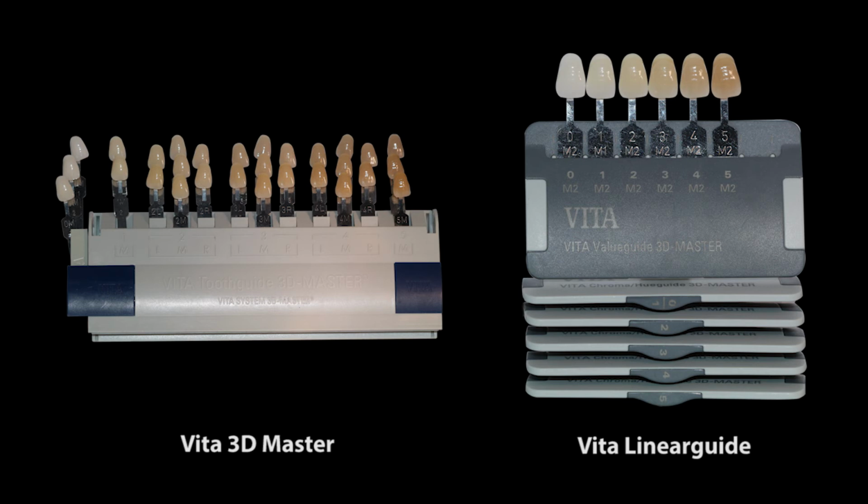It's a phenomenal tool for you to communicate color back to the laboratory. It gives us the ability to mix and match porcelains together so that we really truly give you the best quality product possible. To enhance that even further, I'd like to get a little bit of this presentation and talk about cameras and how we use digital cameras in communicating that color to the laboratory. So now we have a good reference on how to pick a shade. Again, let's talk about documentation for the laboratory and even for your reference, for your case records on the patient.